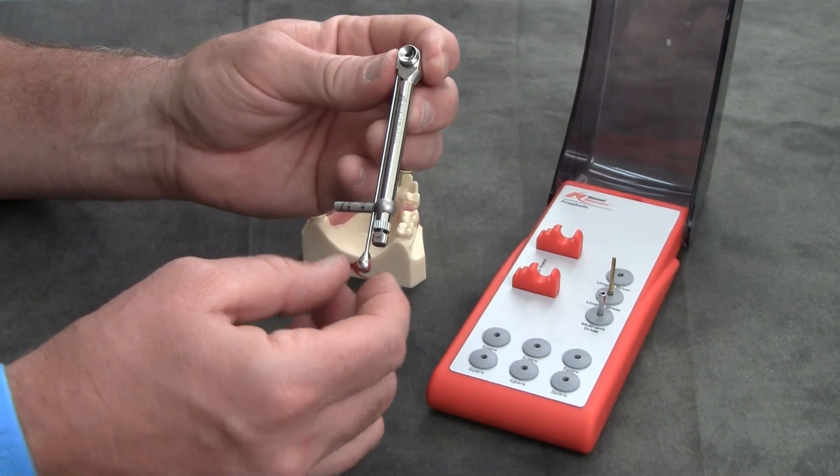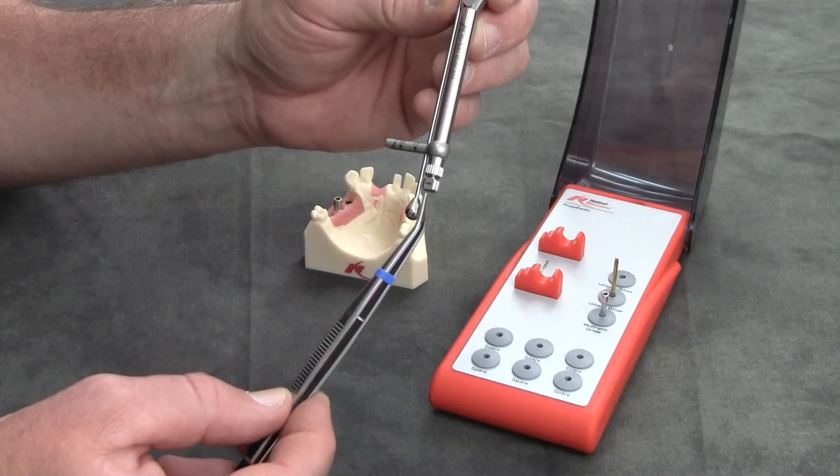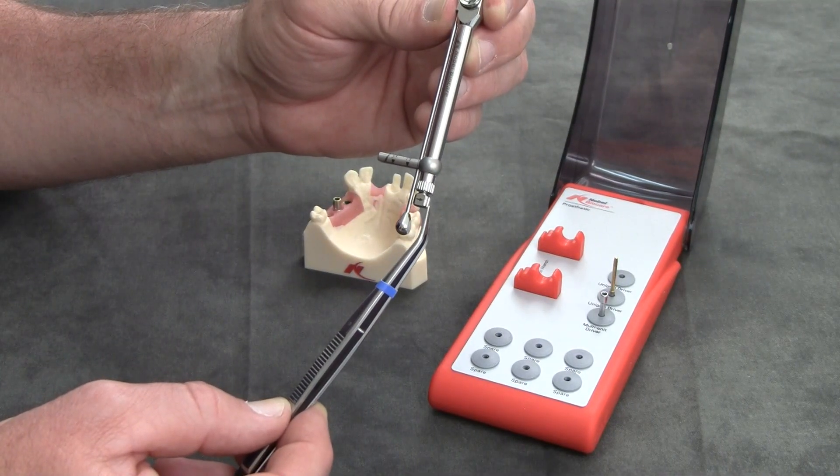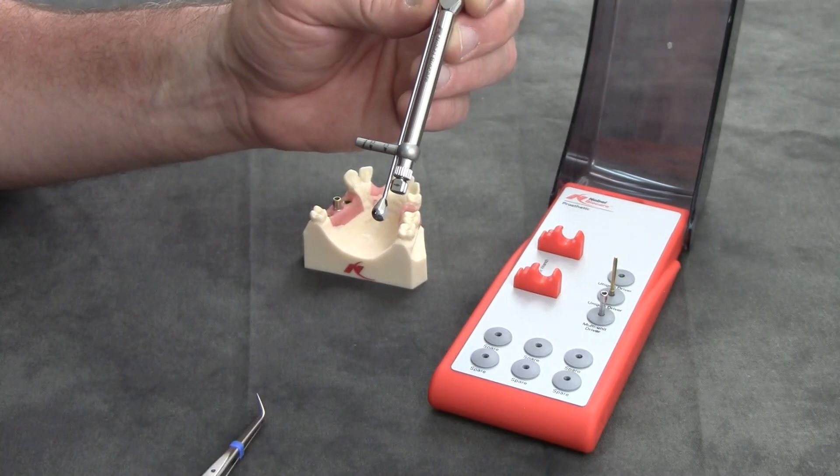One important feature is to make sure that the directional arrow here at the back of the torque wrench is facing you. I'm going to zoom in here a little so you can see that.